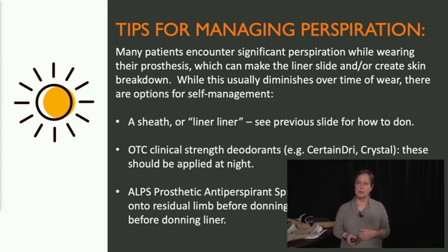Tips for managing perspiration. It took me forever to learn this too. I love these tips. So many of our patients struggle with this. So I already talked about the sheath or the liner. Liner is a method for managing perspiration. There are also over-the-counter deodorants that are clinical strength now that patients can use. Make sure you read the instructions. Some of them want you to apply them the night before, so they manage the size of your pores. So Certain Dry is one. And again, these are available now over the counter.